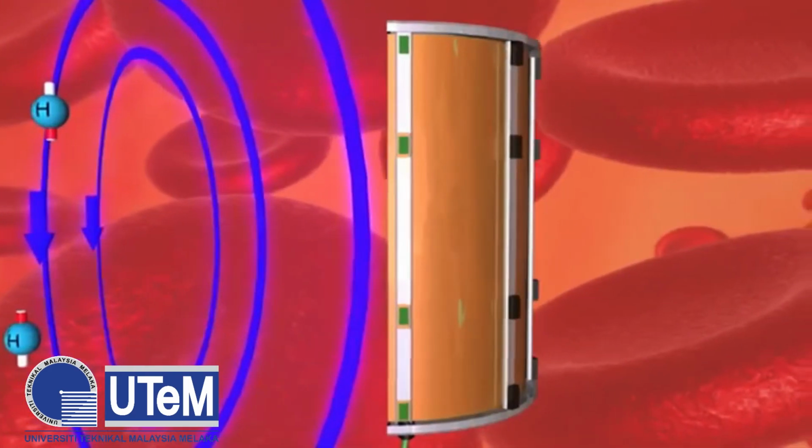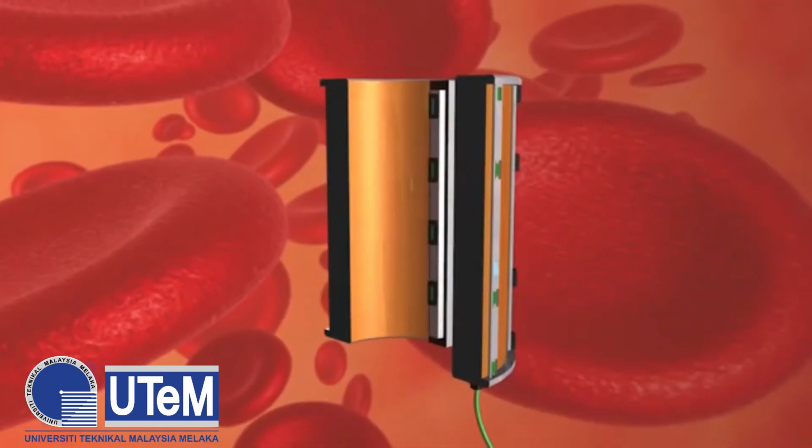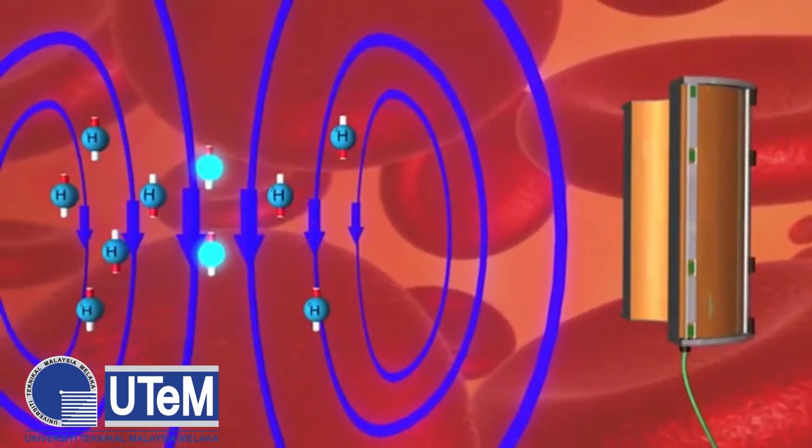Inside the MRI, an RF coil is placed near the part of the body being scanned. This is a radio antenna that transmits and receives radio frequency, or RF, waves. The MRI technologist uses it to send RF pulses at the resonant frequency of the spinning protons.